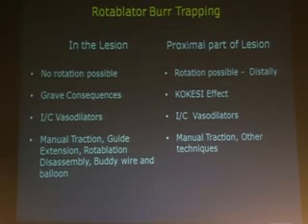There are so many ways by which you can handle this. By putting in a guide extension, you have to disassemble the rotablator by cutting it, taking out the sheath, and trying to put in another wire, dilate that particular area with a balloon, and then take out the burr. But less is known about the other phenomenon, which was perhaps seen in our case.